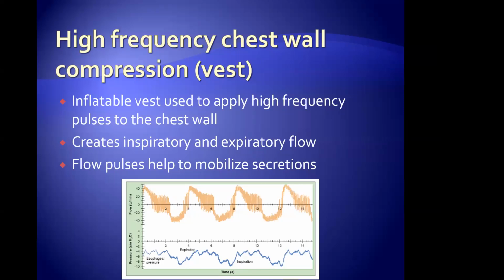So we have that vest, crank it up. Get it right there where the patient's like, okay, I feel it. And again, if you're at the bedside, you place your healing hands on that patient when that chest wall is vibrating, it's significant. The whole time it's going through the process of breaking it up, collecting, and moving it forward. So again, it helps move secretions safely out of the chest wall, which is what we want to have happen. Move it forward.